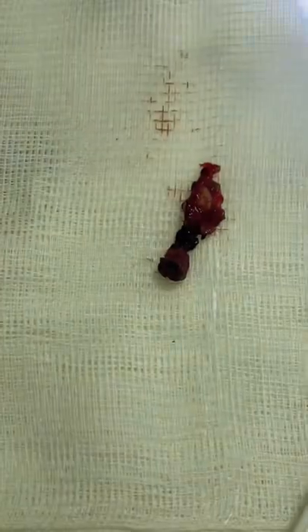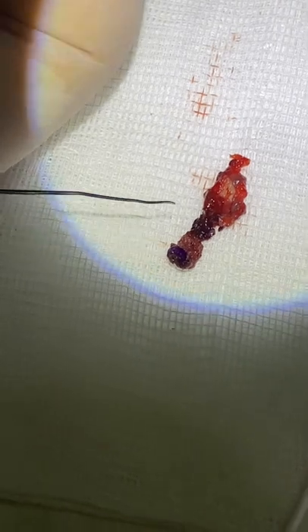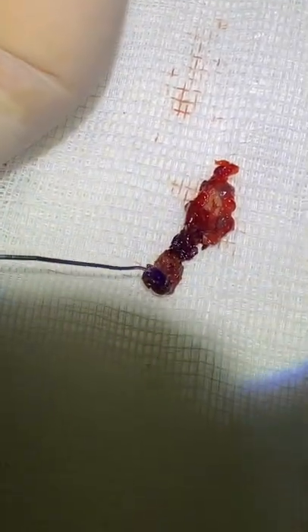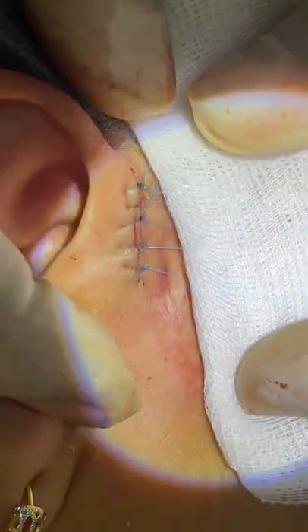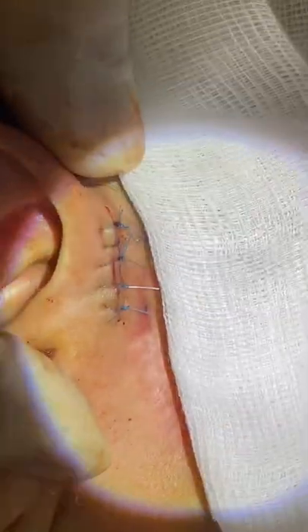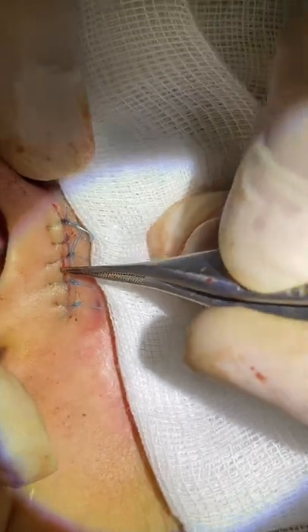This is the sinus that we removed — this is the skin end and this is the deeper part of the sinus. It's quite long but I'm confident that we have removed everything. We have completed the procedure and made five small stitches — one, two, three, four, five — on a two-centimeter wound. Expectedly in one week's time this will already be healed.